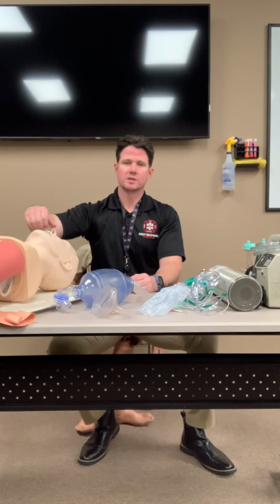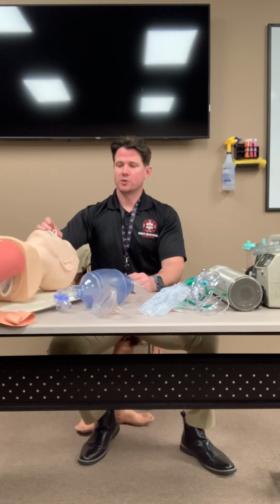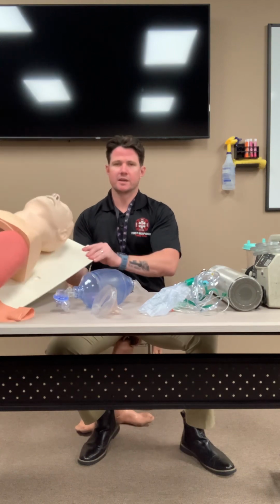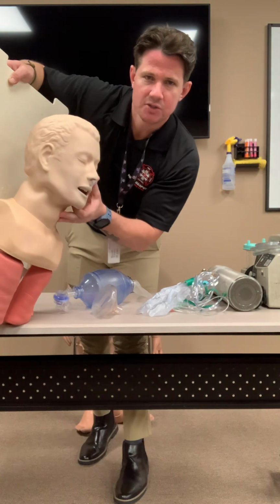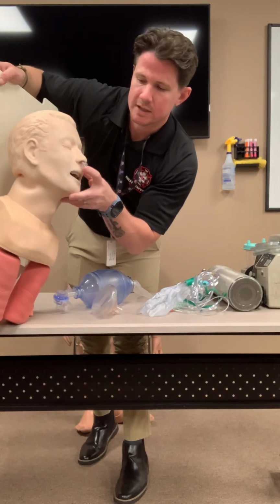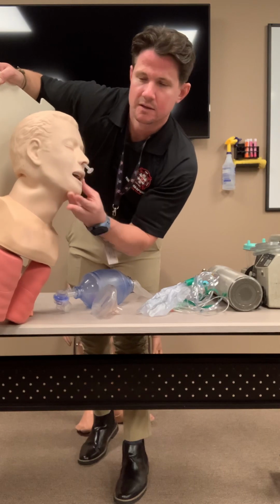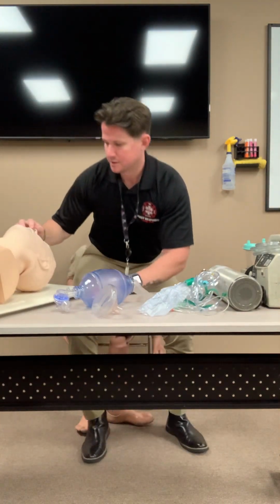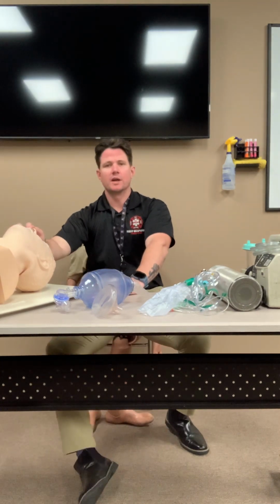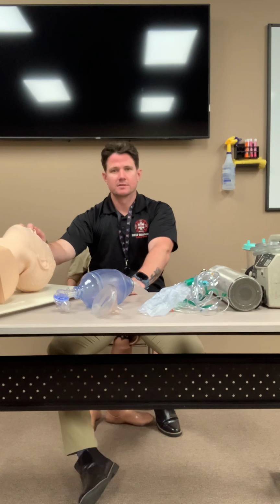If it's difficult, you can spin the NPA. It'll facilitate insertion. And you are going to insert it until, once again, I know it's kind of hard to see here, but the flange is at the base of the nose. All right, that is this. That's incorrect, okay? All right. Your indications for your NPA are going to be a patient with an intact gag reflex, okay?